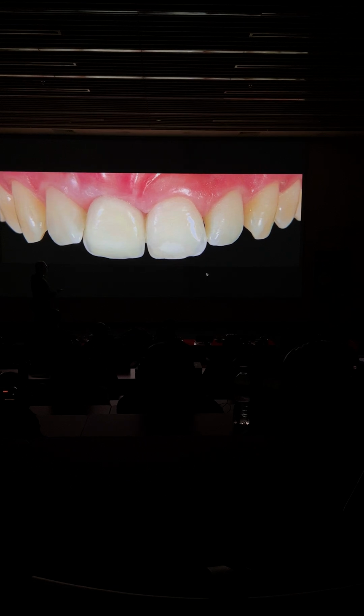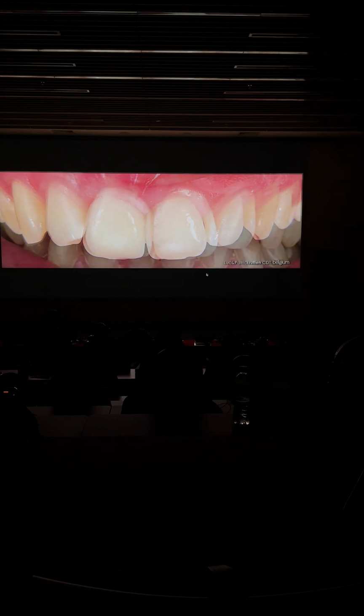As I told you yesterday, you have to check the rest of the contact points. And usually we close the contact points if there is no contact, because if not, the teeth are going to drift. Here we close the space. And this is how I started, how I finish. It's not ideal. Time we do the rest.